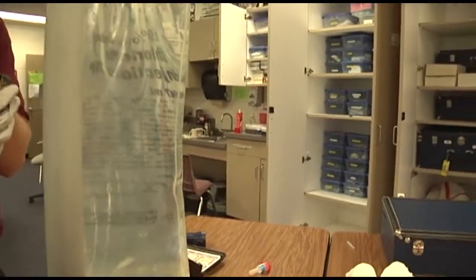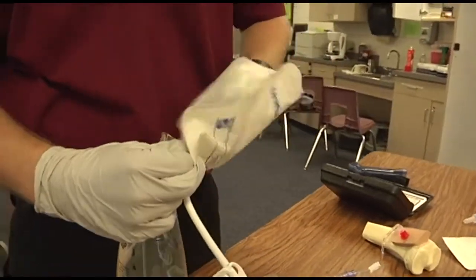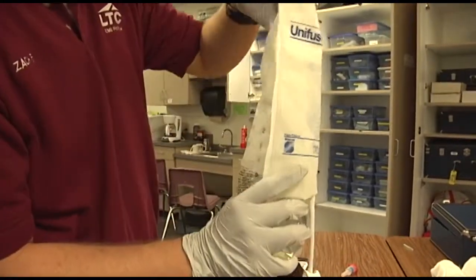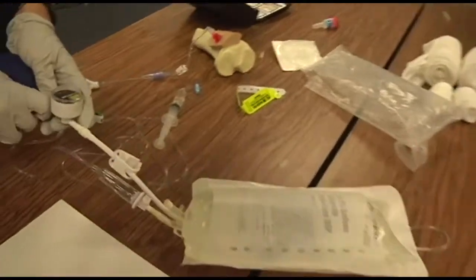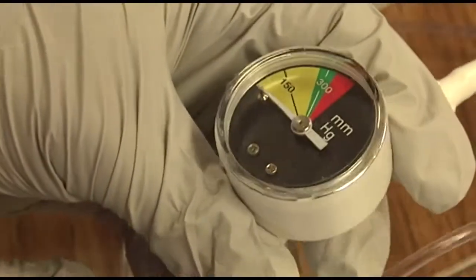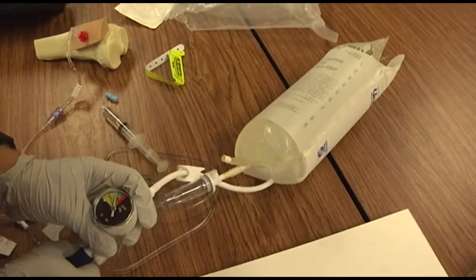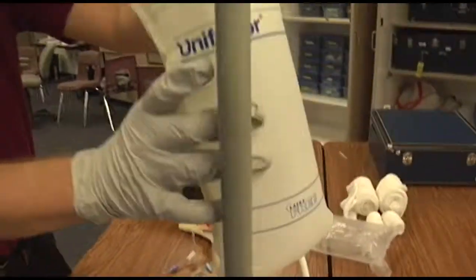Connects administration set and begins infusion with pressure. Close off the bag and inflate that to the green zone, approximately 300 mmHg. Don't forget to clip the safety.